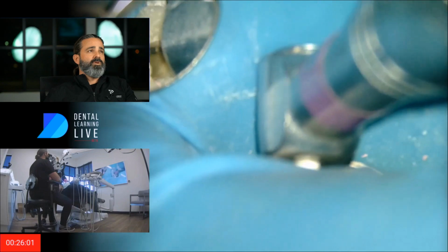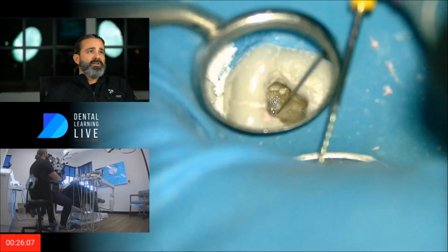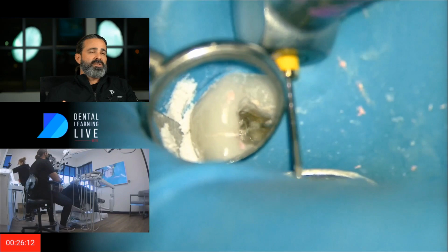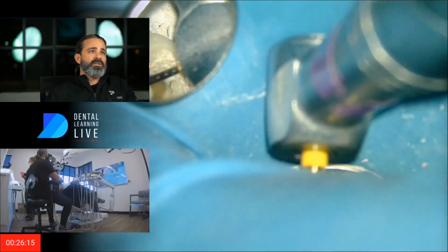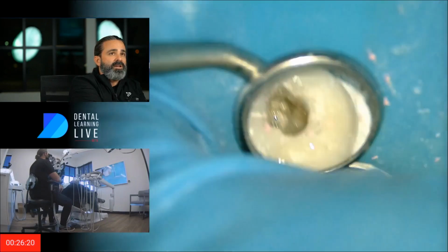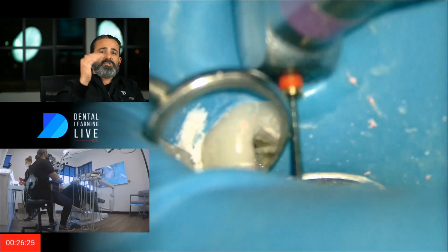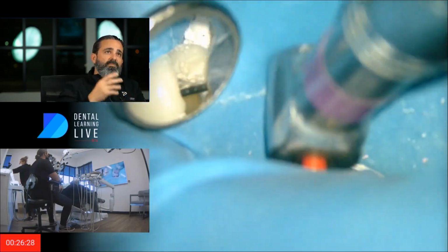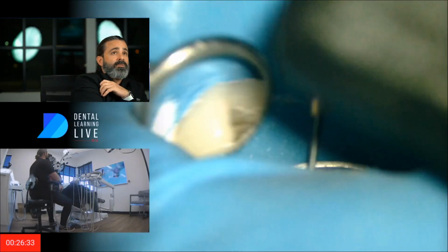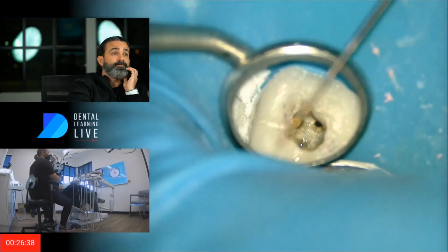This one's a 15 04, and I am getting a little bit of pinching and grabbing of some softened gutta percha down there. And I also know my lengths. When I do this, I'm actually using a calibrated file, obviously, and I'm measuring on that cavosurface margin, which is kind of hard to see, but I'm actually coming down to the margin here with that file. Even though it's going fast, I've got a lot of muscle memory in my fingertips, but that's what I'm looking at. That's why my mirror tips to the side, because I'm measuring every one of those bounces, gauging where I'm at.